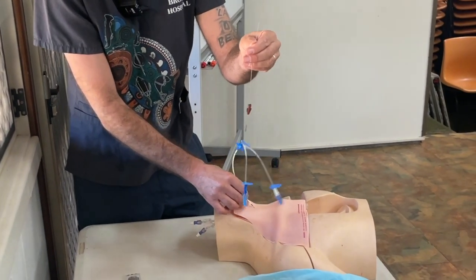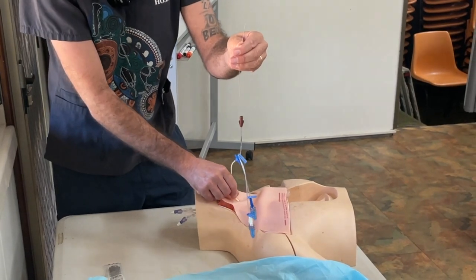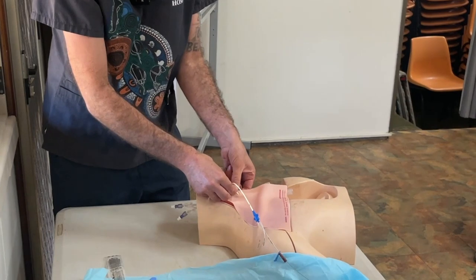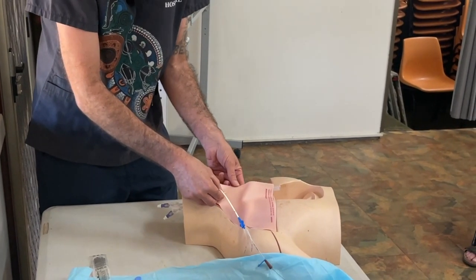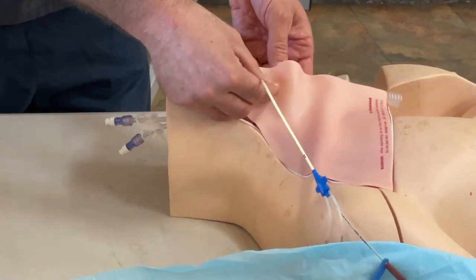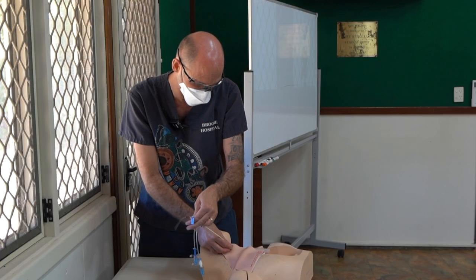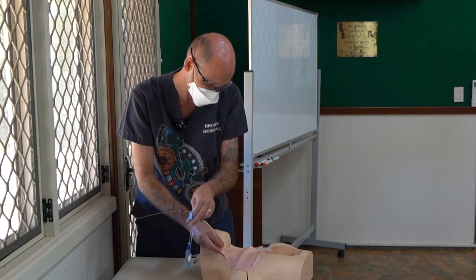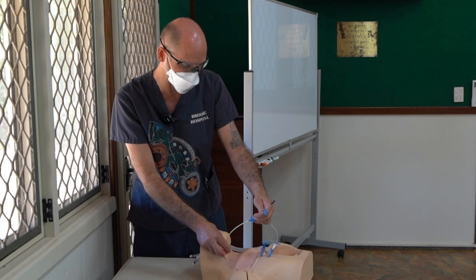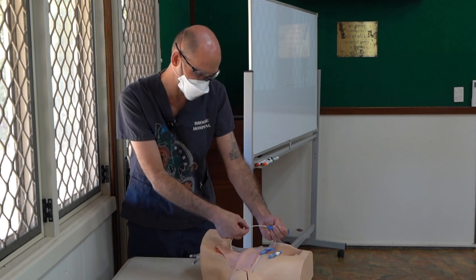Now I can just feed the catheter in gently, twizzling a couple of centimetres as I go down. This is going into a plastic PVC pipe mannequin, so just bear with me. It's gone through, gone in — in about 10 centimetres. I put it down to about 15 centimetres.